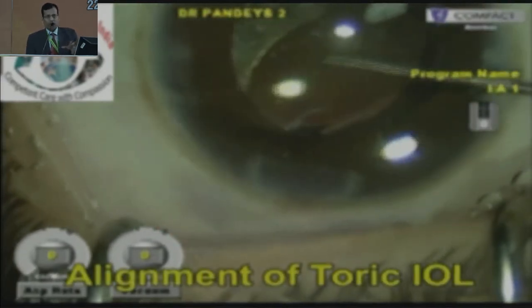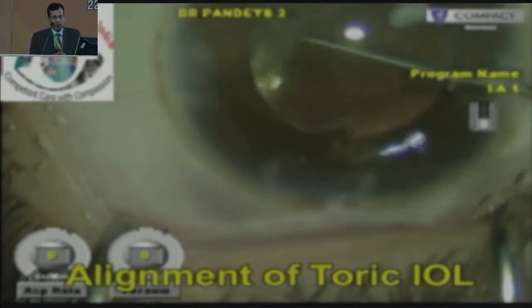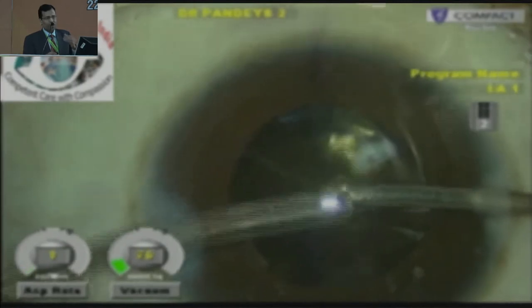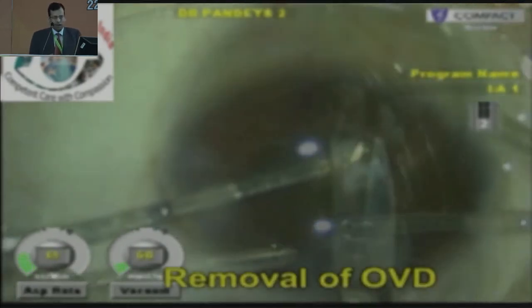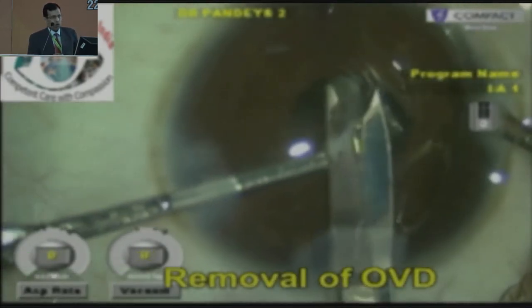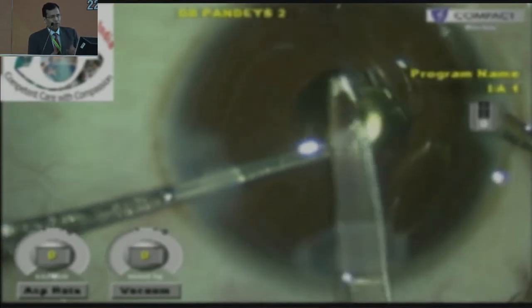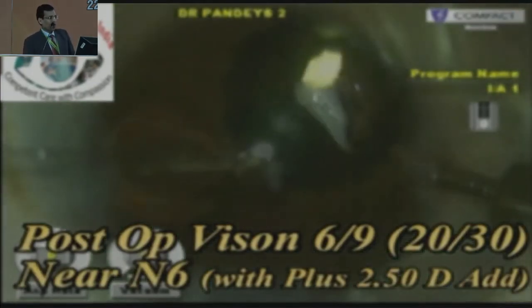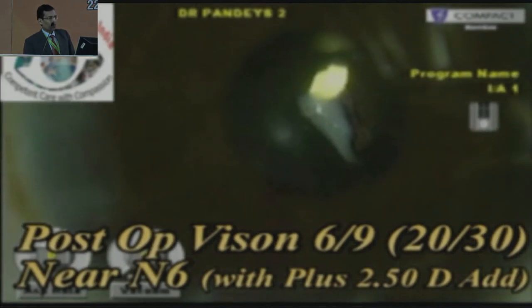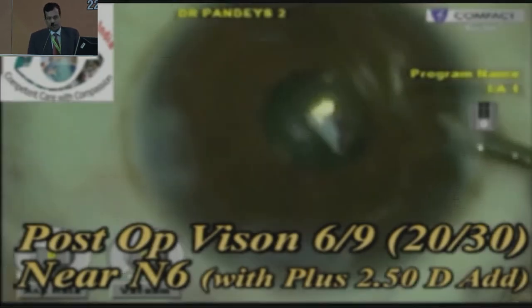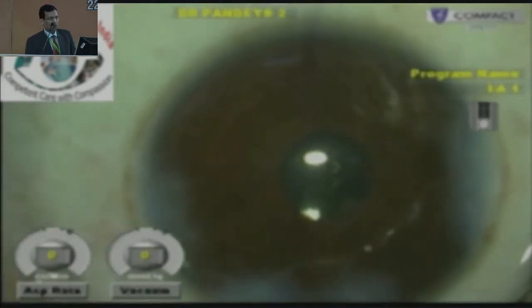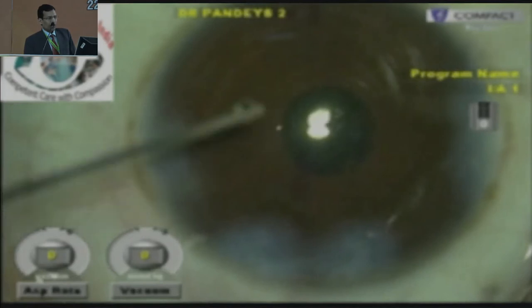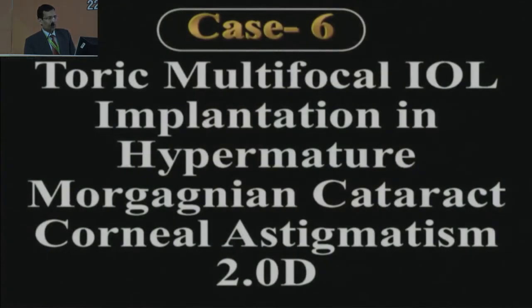In this way, I was able to implant the lens in the capsular fornices. The residual cortex and fibrotic capsule were cut with the Vanass scissors. Here you can see a nice round pupil with a clear visual axis. This patient regained good vision. As in all my practice, I use intracameral lignocaine and intracameral moxifloxacin in all my cases.